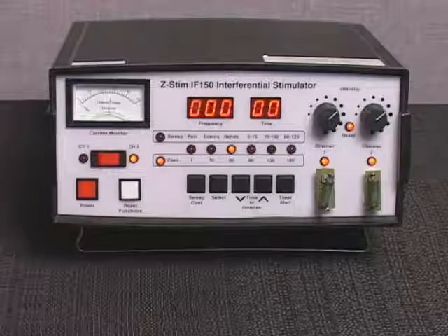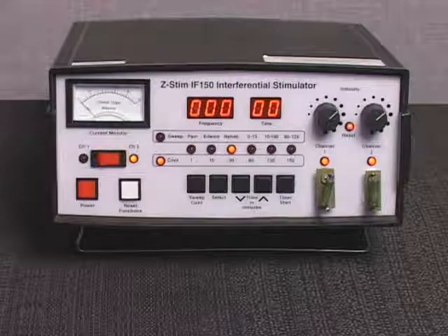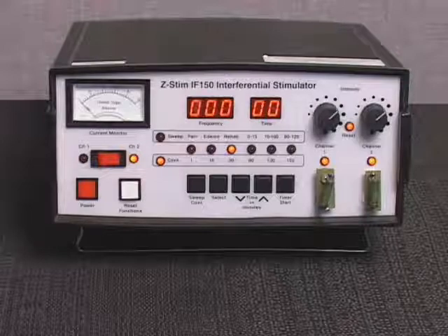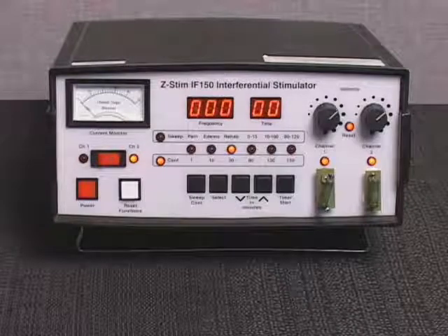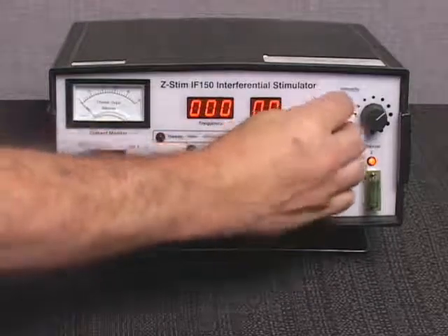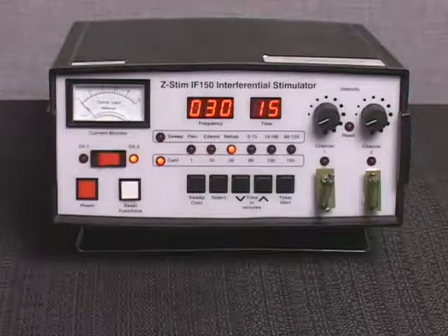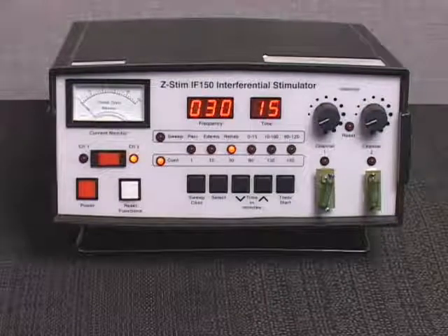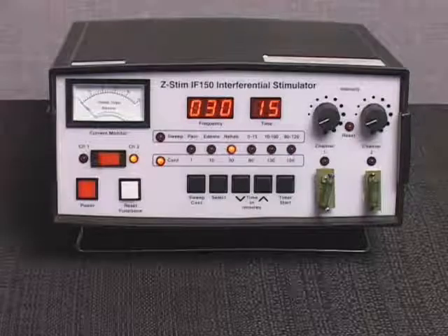The output level for channel 2 must not vary more than plus or minus 20% from the output level of channel 1. When treatment is completed, stimulator output will be discontinued immediately. The treatment duration reduces to zero as indicated on the power timer display, the reset intensities indicator light flashes, and the generator emits an audible signal. The intensity controls must be returned to the zero reset positions, enabling the audible clicks, which will turn off the reset intensities indicator light and the audible signal. The treatment time will default to the factory setting.